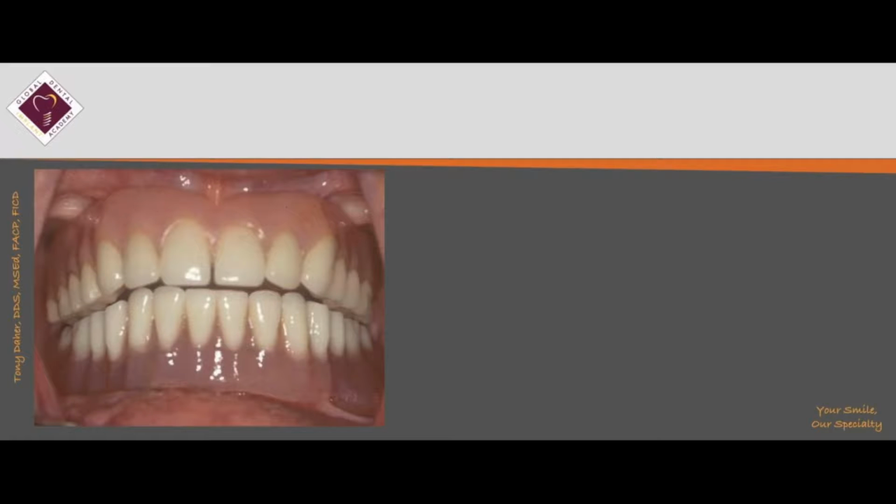The first thing I do is take that denture and try to snap it over these ball attachments. You have some retention given by these ball abutments. Now, certainly one is not very adequate because of inadequate cuff height, but retention exists. Now I ask the patient to put the tongue on the roof of the mouth, move it back slowly while closing, and once the teeth start to contact, to stop.